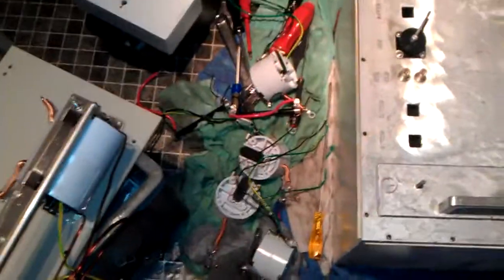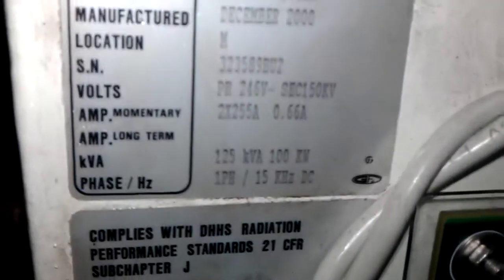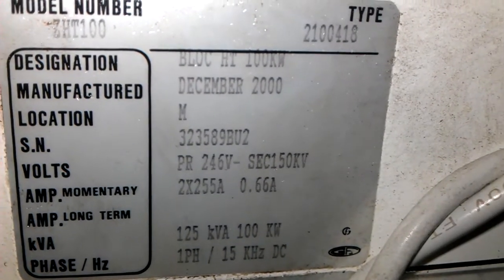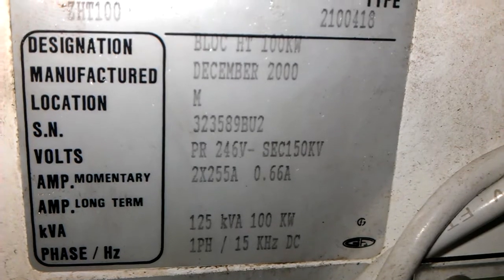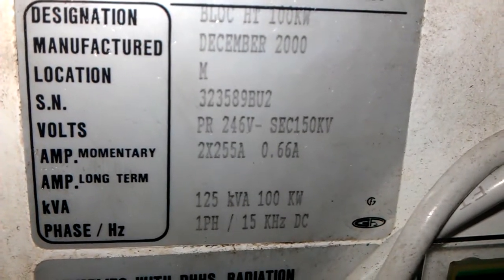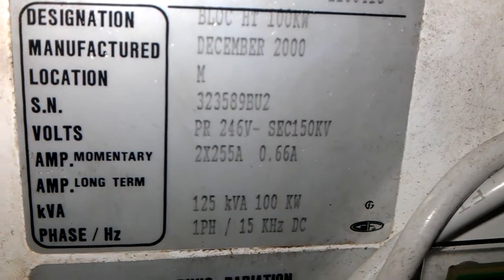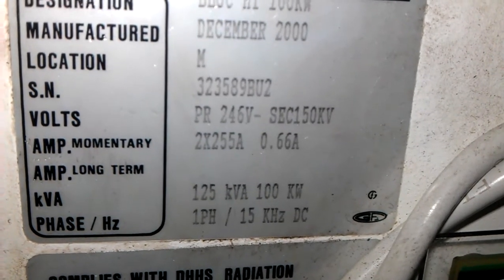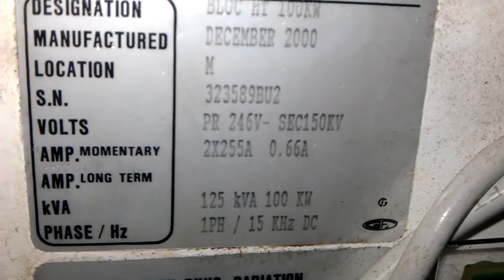There were four ferrite transformers — flybacks as I always call them — and four of these 75kV transformers which run on a DC frequency, which I'll show you just here. As you can see, the primary is 246 volts and the secondary is 150kV, 100kW — that is some serious power, more than your house. And 125kVA at 1-phase to 15kHz DC. That is the phase frequency that basically powers these things.